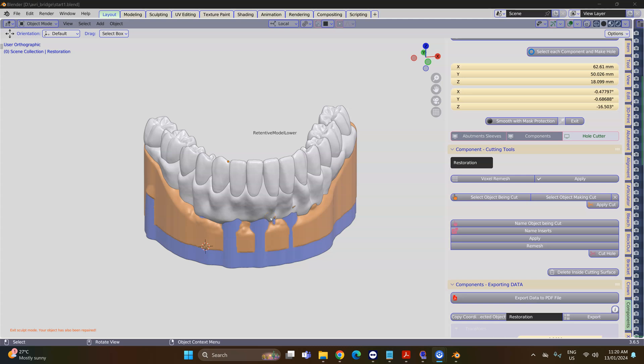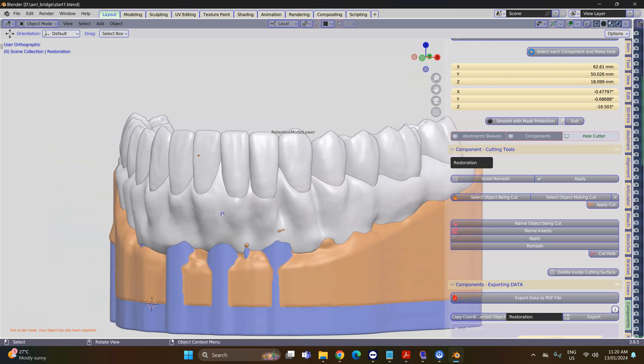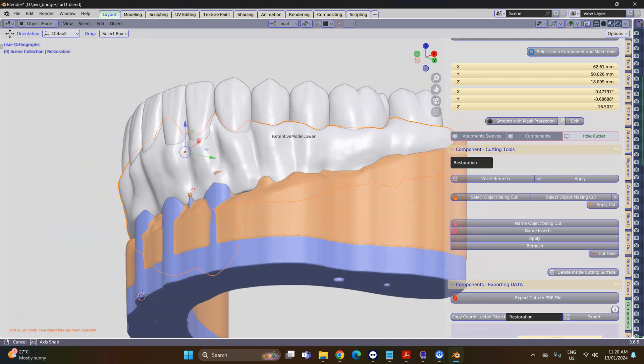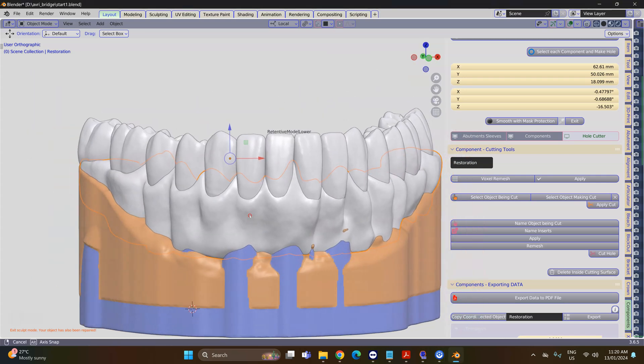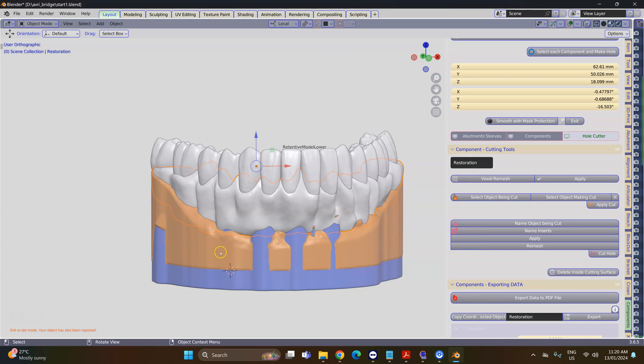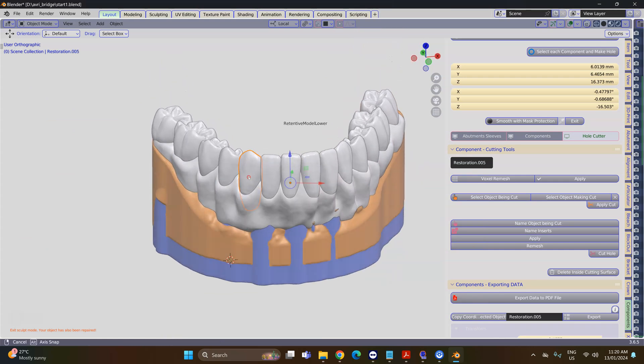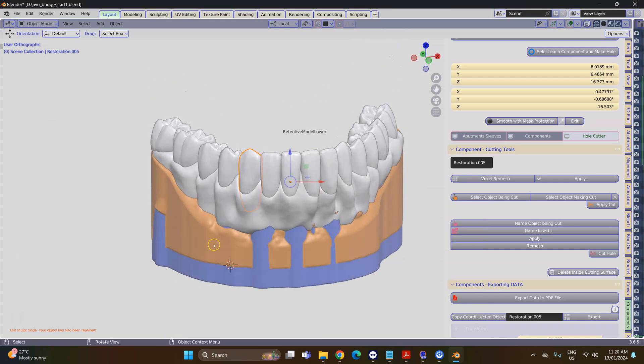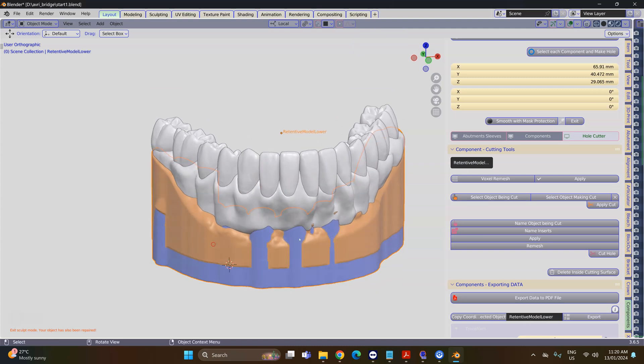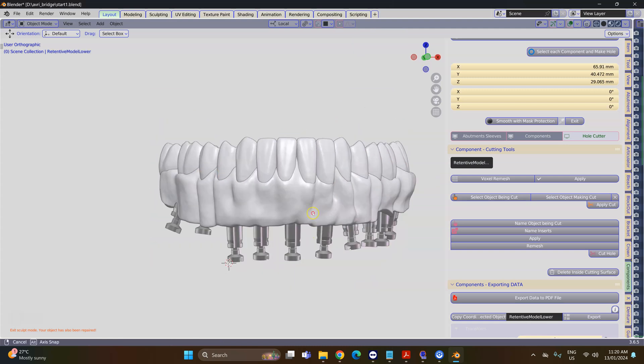In this video we have a tooth setup and sculpted gum. We'd like to reduce the gum so we can put porcelain or composite over the top. We also want to make thimbles that will be connected to implants underneath.